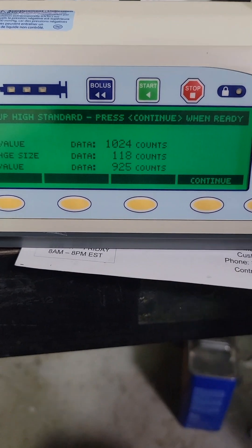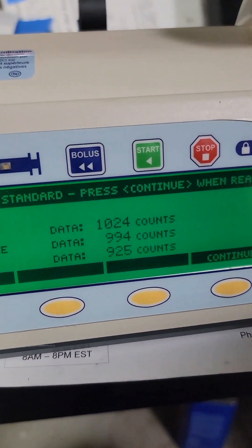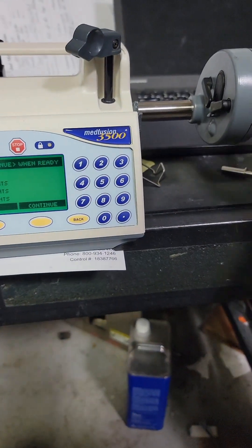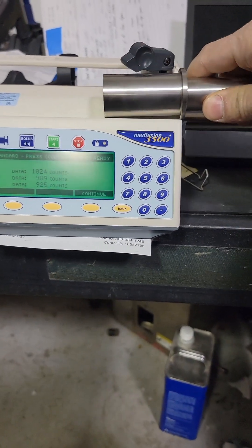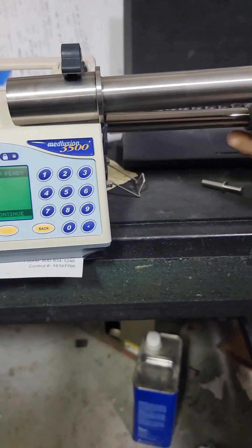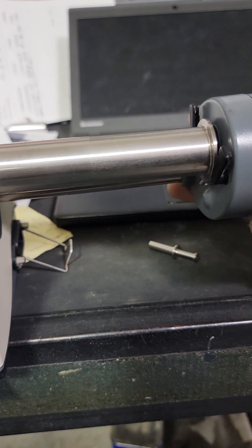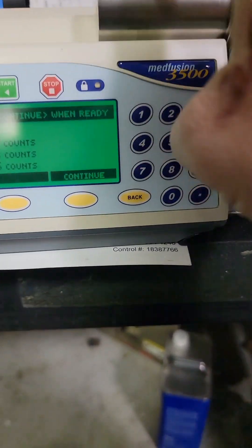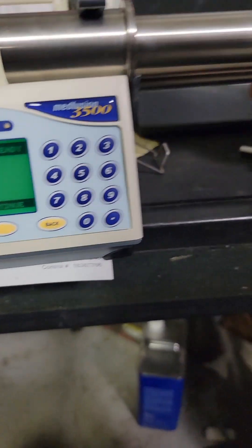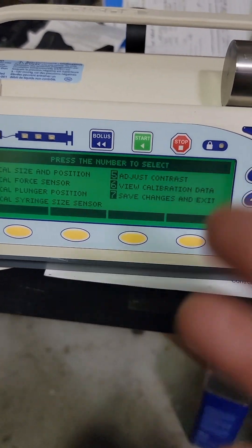Pull that guy out and this big one here. Pull that all the way out, drop this in, try to wiggle it in the flange. There we go, sitting properly. Remember the first thing is the size of the syringe — continue. And now this guy over here, back and forth, make sure it's nice and snug, make sure the number — continue. And that is the high. That is it for cal size and position.